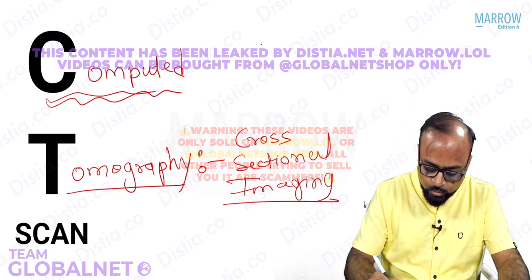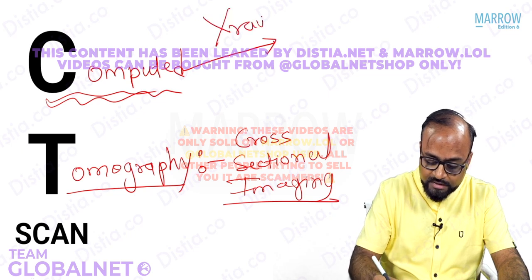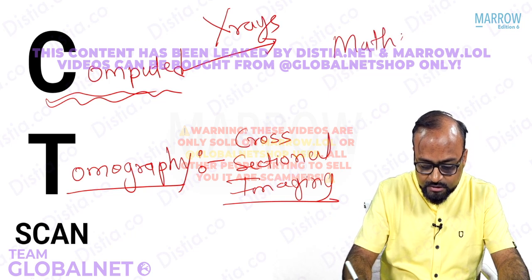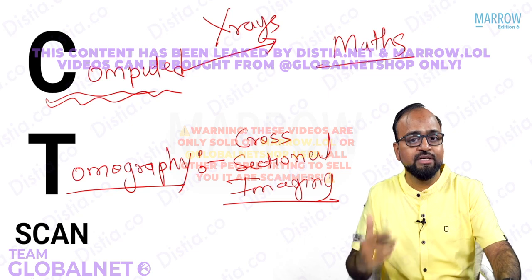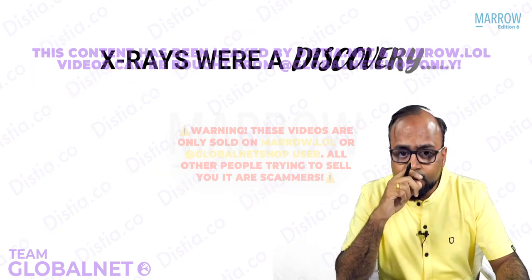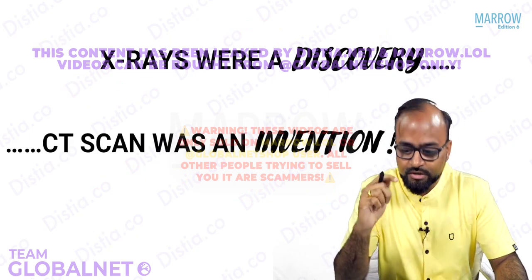So computed tomography basically uses X-rays. The computer does a lot of mathematics involved in image reconstruction, and the tomographic setup actually gets the tomographic data. So remember, X-rays were a discovery, but CT scan was an invention.